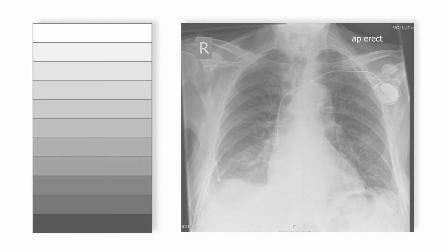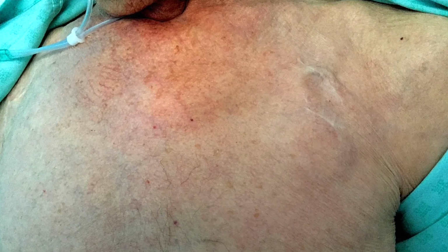In this case, the metal is a cardiac pacemaker that the patient had implanted in the top left hand of their chest.